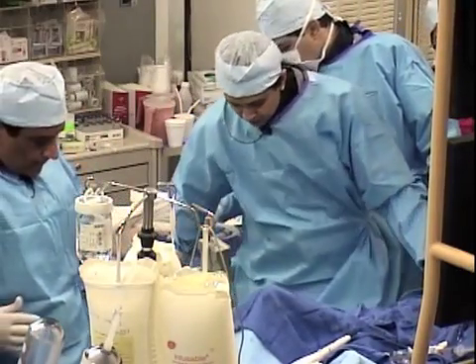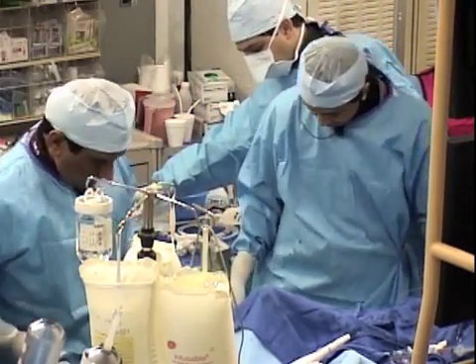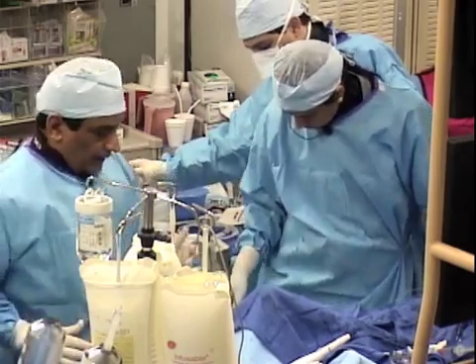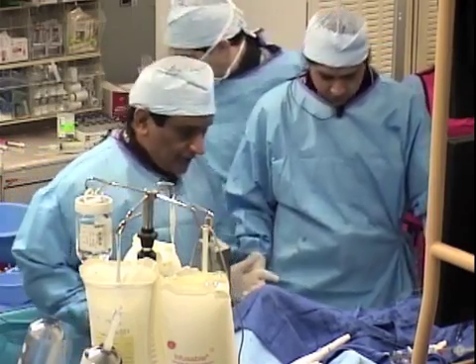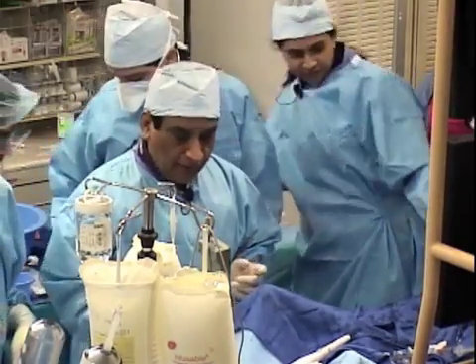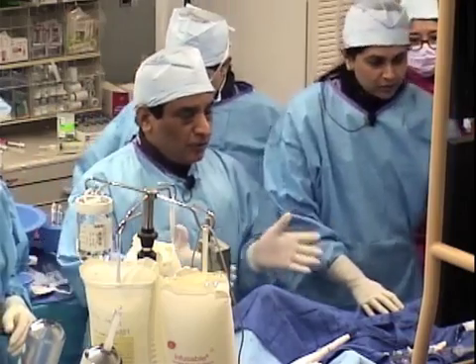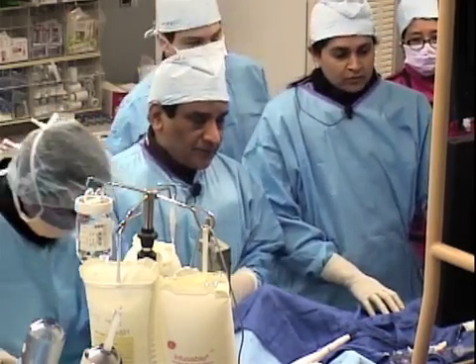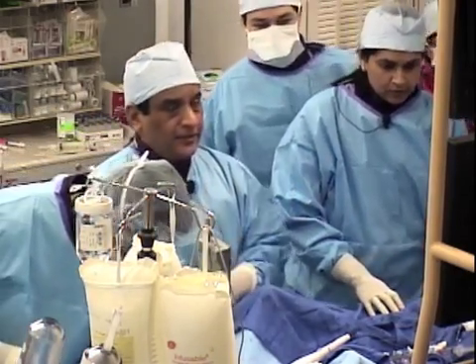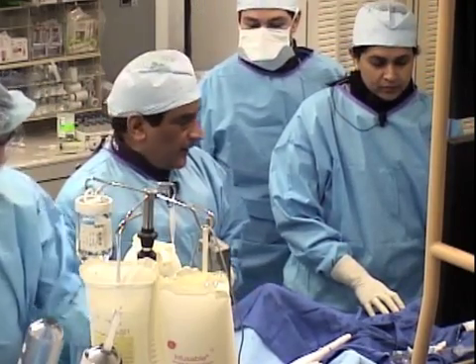Another question: have you started using OCT, and how is that going to complement IVUS? Well, very good point. The believers of OCT say that IVUS is history, but we will actually do the OCT in the end, after the stent deployment, because I think OCT is not going to help much here. IVUS could help because of the calcification which we saw, but OCT we are definitely going to perform in this particular case at the end of the procedure.